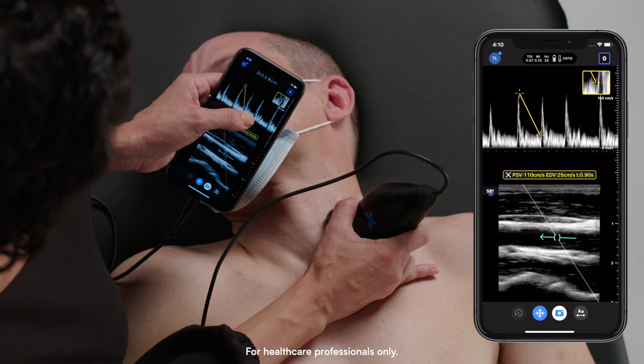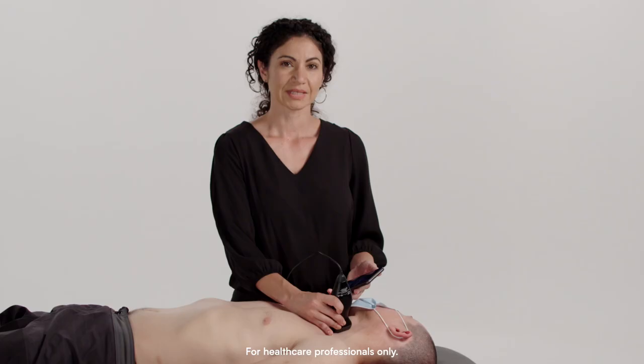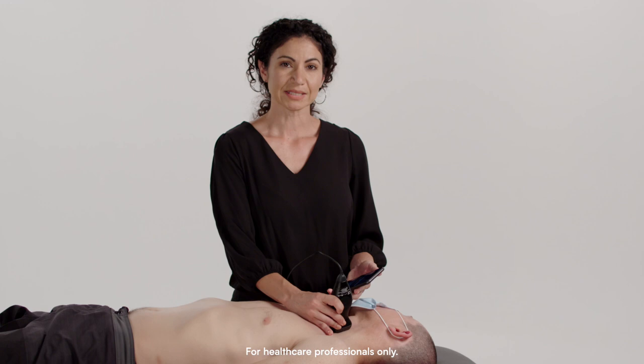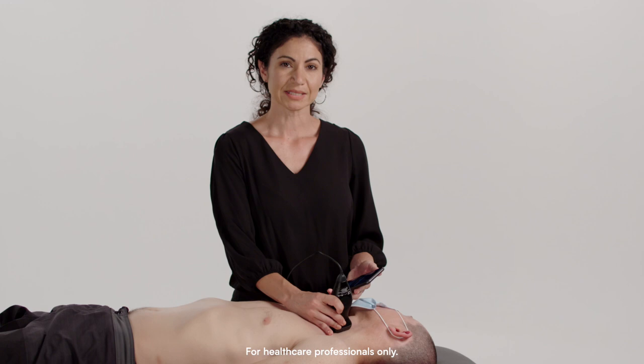You'll see on the screen PSV for peak systolic velocity and EDV for end diastolic velocity measurements. And that's how you perform the Pulse Wave Doppler in the carotid preset in the Butterfly IQ+.